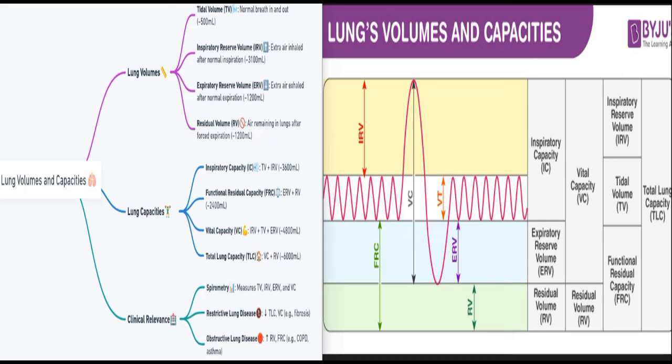But when it comes to the percentage change, which is the change in FEV1 over the pre-FEV1 times 100%, you have 300 over 3000 times 100%, that is 10%. So though the change in FEV1 exceeds 200 mils, the percentage change is less than 12%, so it's irreversible.